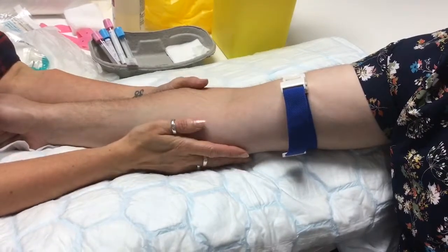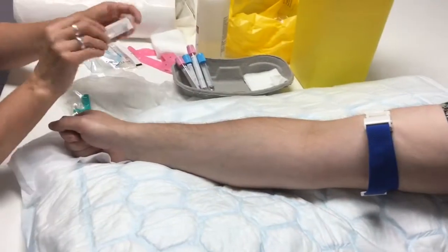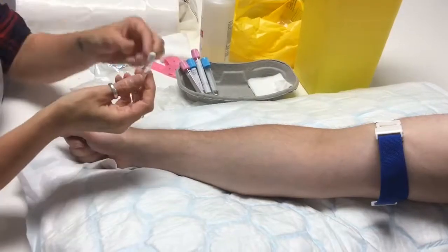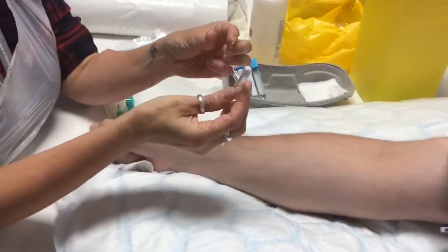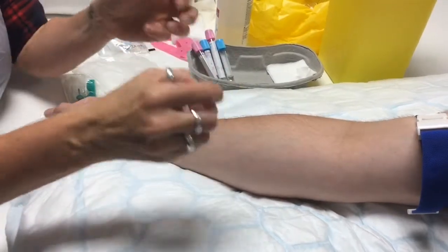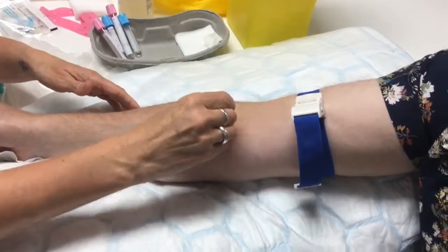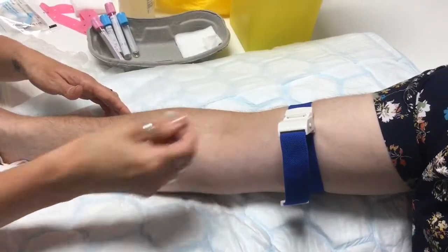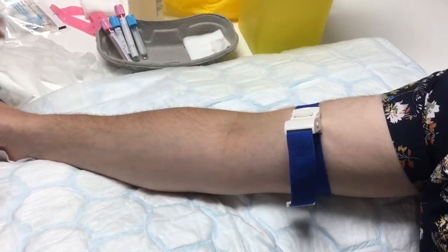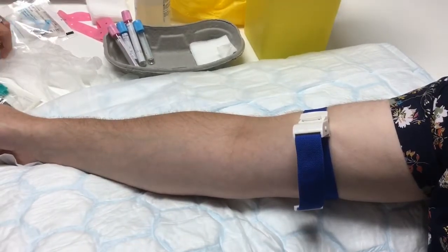That's coming up a little bit there — lovely. The next thing I'm going to do is clean. I'm going to put my gloves on before I do anything more invasive. The chloroprep is a double case — you squeeze it and it breaks, and it infuses down into the gauze. Just clean over the area that you're going to take the sample from. Then leave it alone — don't go back, don't keep prodding it, leave it to air dry. Otherwise if you touch it you've got to clean it again.